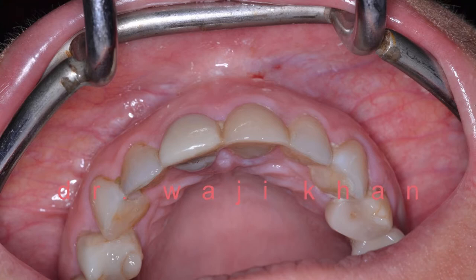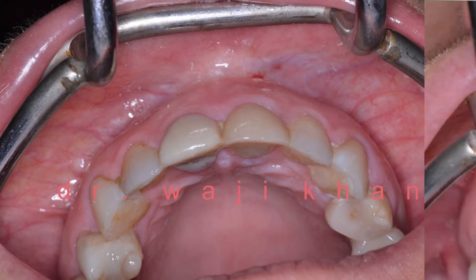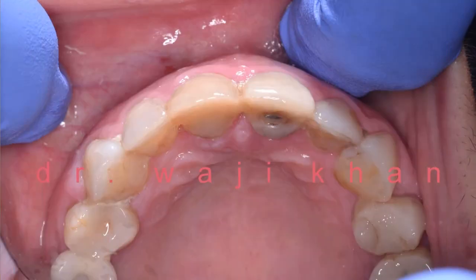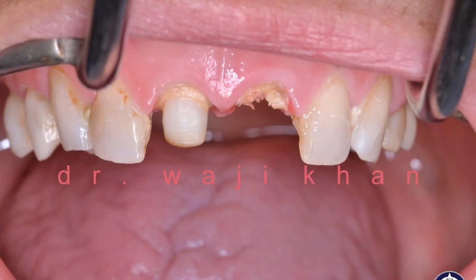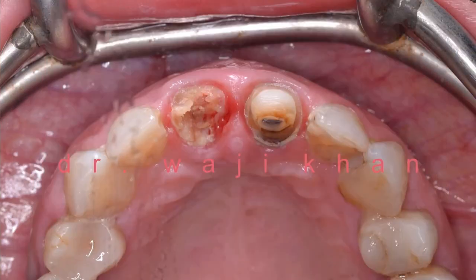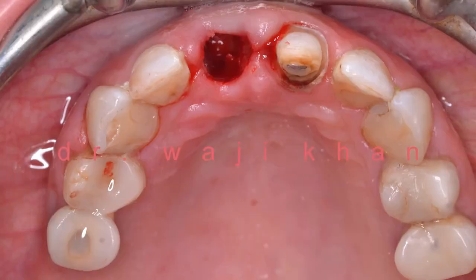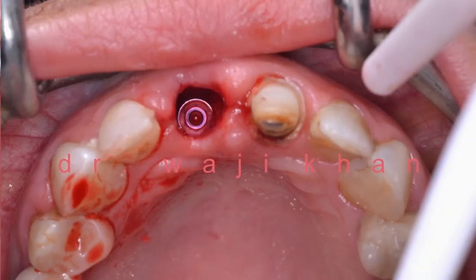Upon retraction of the tissue you can see the occlusal shot for the patient — here's a modified occlusal shot showing the buccal-lingual tissue dimensions on that tooth. Upon taking the tooth off, the crown on the upper right central incisor also popped off. We then proceed with atraumatic removal of the root, appreciating the beautiful thick buccal-lingual tissue, and using a series of pilot burrs we proceed with placement of the implant.